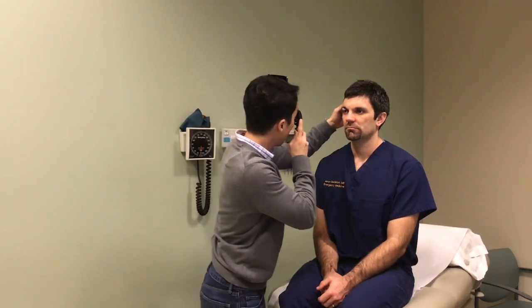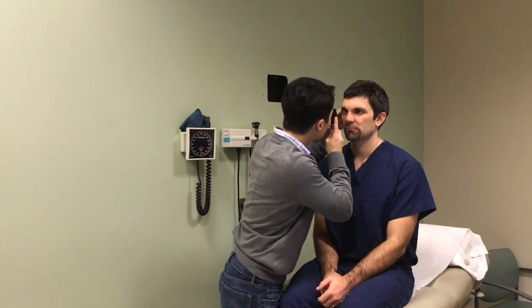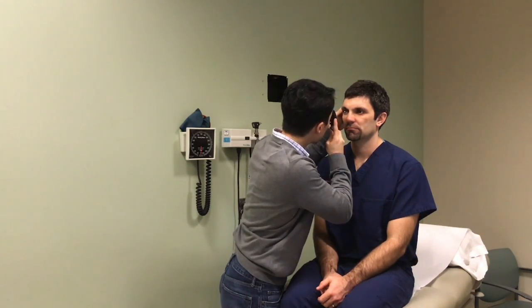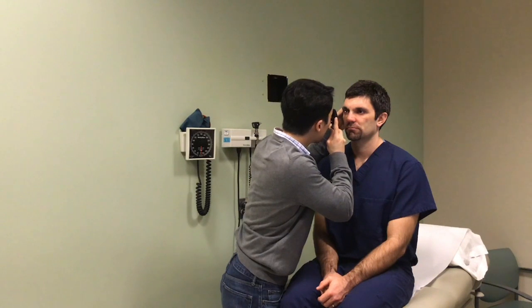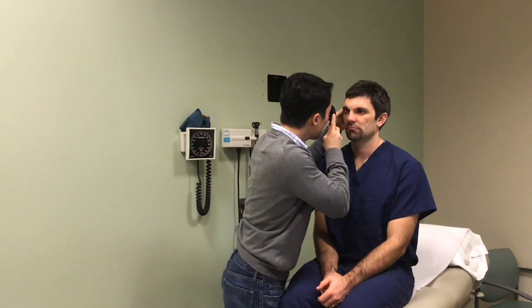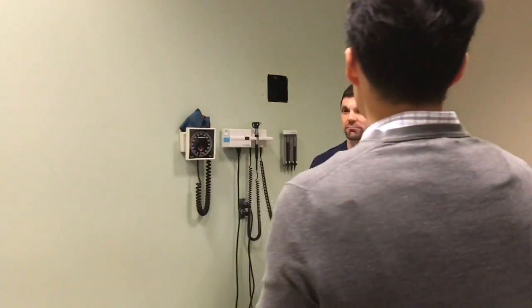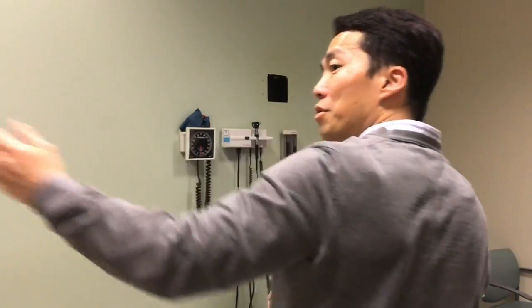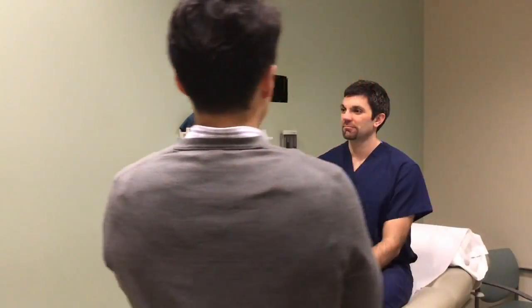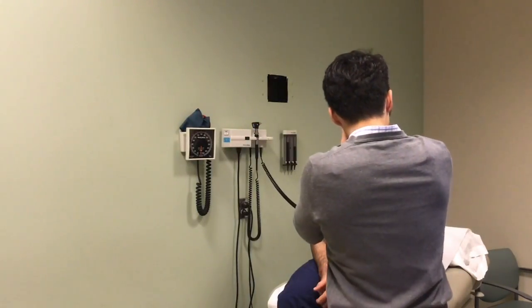Look through the aperture and observe the red reflex. Follow the red reflex in until the retina comes into focus and observe the retina and the optic disc and vessels. You may need to adjust the diopter if the structures are not in focus. Repeat the procedure for the patient's left eye using your left hand and your left eye.